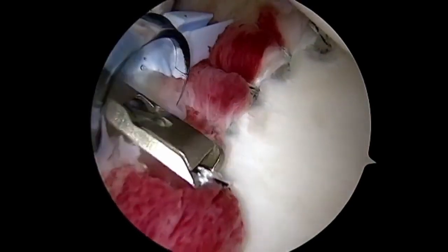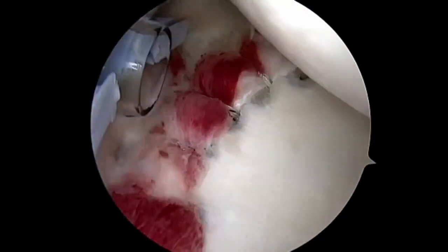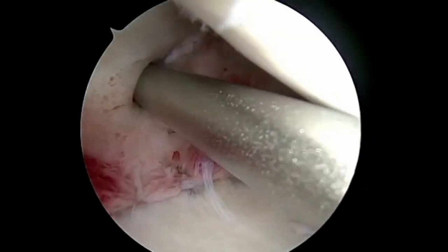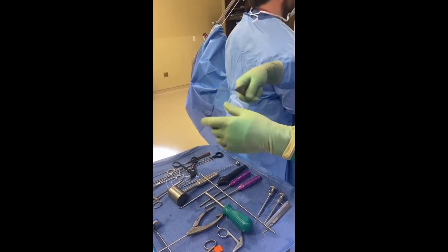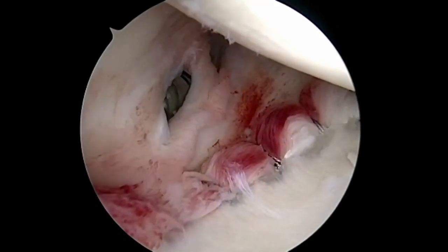So we've placed 5 anchors in this football player, repaired the labrum, and tightened the capsule to prevent future instability episodes. For instability cases, I don't like using this posterior capsulotomy, so we're going to close it. We'll bring in a corkscrew cannula. I'm going to take a suture and load it into a 45-degree bird beak type passing device.